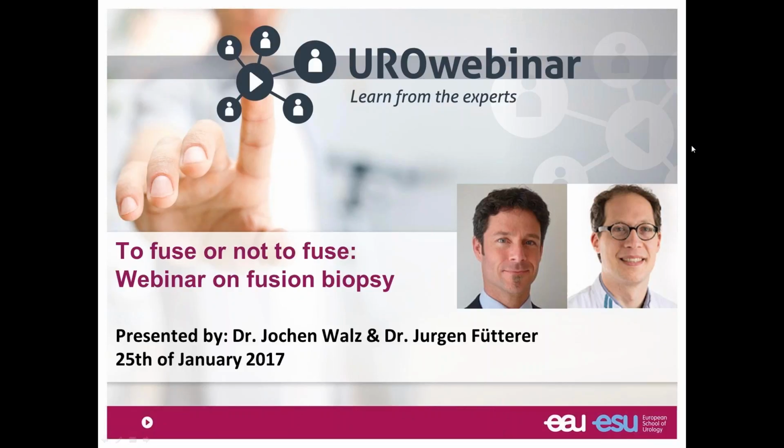Yeah, from the several studies we know, for example, the previous study, we know that around 25 to 30% of the patients who opt for active surveillance and who get an MRI and an MRI targeted biopsy will be upstaged, so will not be eligible for active surveillance. So I think quite often MRI is being recommended before inclusion for active surveillance. And that's done more and more in our clinical practice.